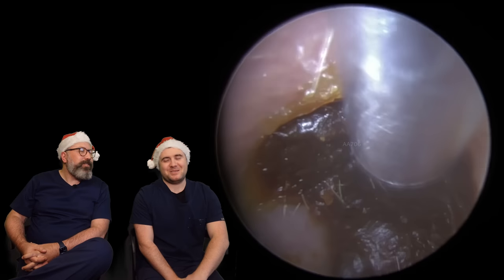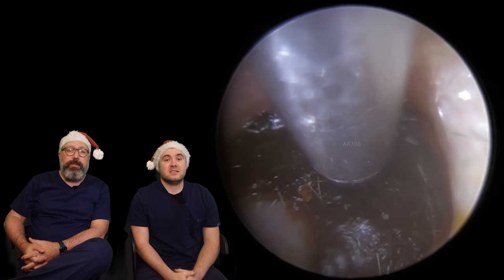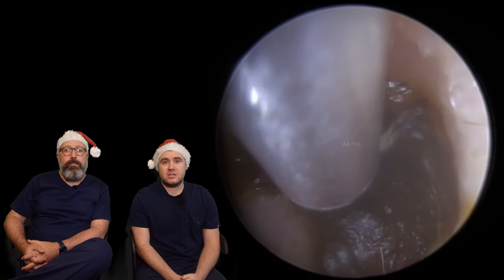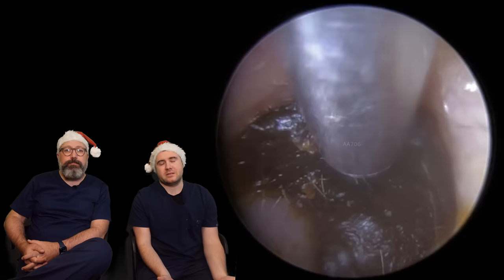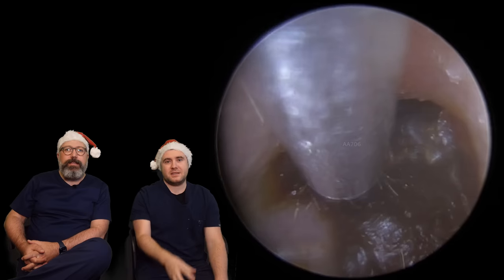Not as nice as the chocolate ones — not quite as tasty, unfortunately. So this is your patient? Yes, this is mine. So as you can see straight away, cotton buds. Cotton buds straight away. Textbook — there's a dent in the bottom of the wax there.